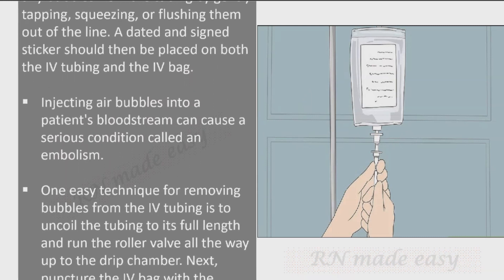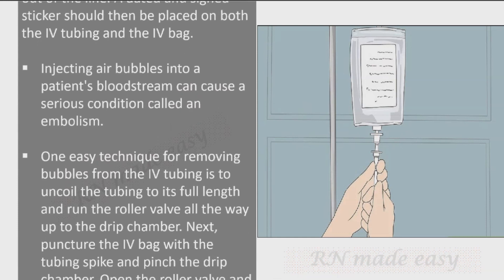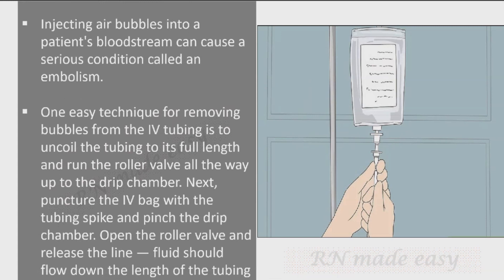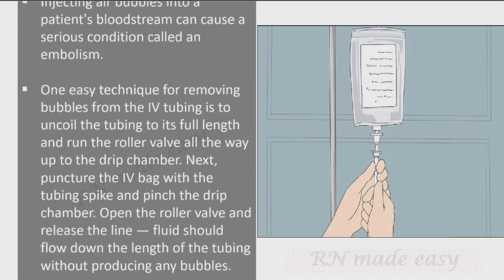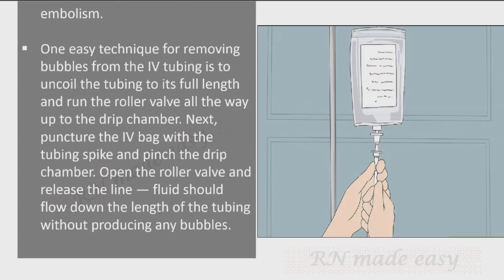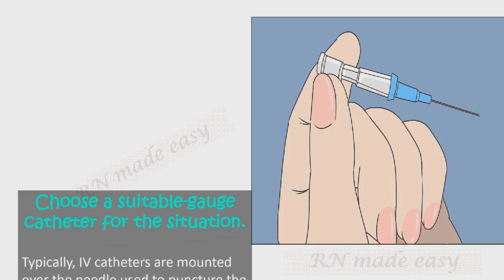Injecting air bubbles into a patient's bloodstream can cause a serious condition called an embolism. One easy technique for removing bubbles is to uncoil the tubing to its full length and run the roller valve all the way up to the drip chamber. Next, puncture the IV bag with the tubing spike, pinch the drip chamber, open the roller valve, and release the line. Fluid should flow down the length of the tubing without producing any bubbles.